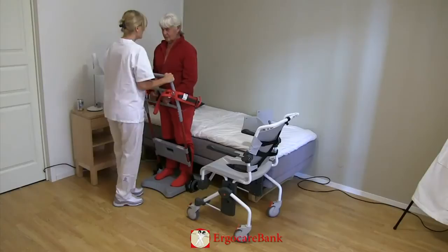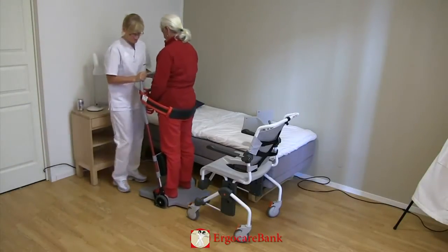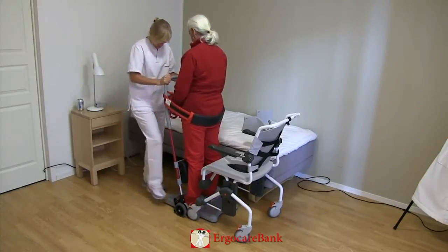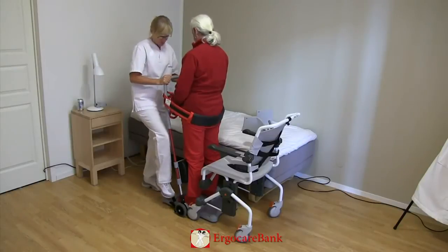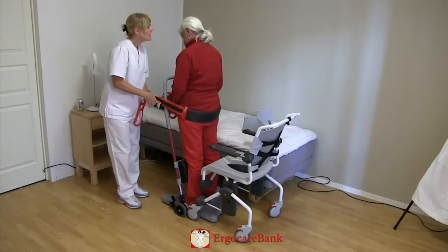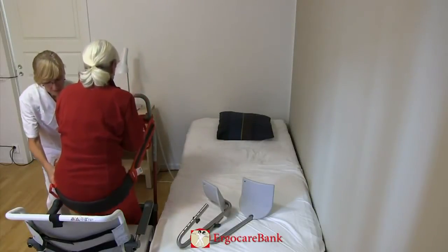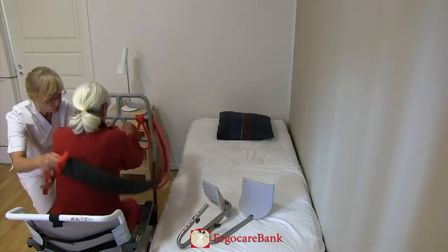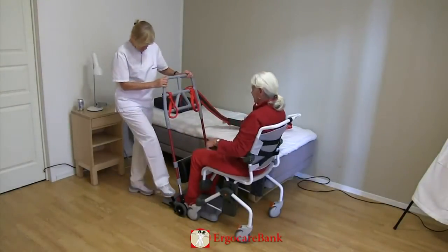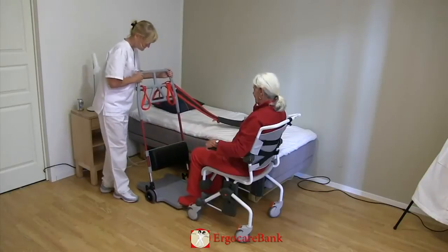The staff member unlocks the brakes of the razor, backs out from the bed, turns 90 degrees and drives into the shower chair and locks the wheels of the razor. The staff member unhooks the belt from the razor and on one, two, three, Celia is slowly lowered into the shower chair and the belt is removed. The razor is removed.